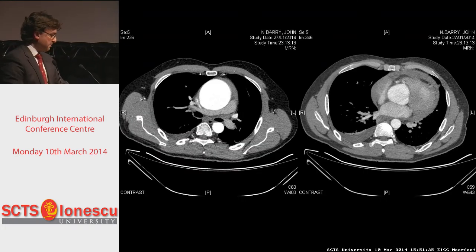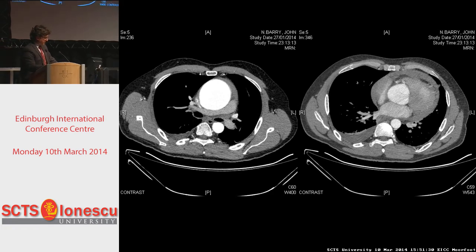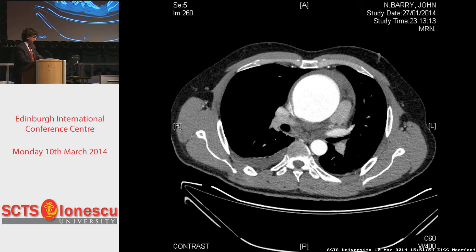This situation, actually, was a couple of months ago. This patient came and he had a very large ascending aortic aneurysm. I was getting ready for antegrade arterial cannulation in his aorta. As you may know, there is a pericardial effusion there as well. And looking closer to it, and that was afterwards, unfortunately, you can see a little nipple there.